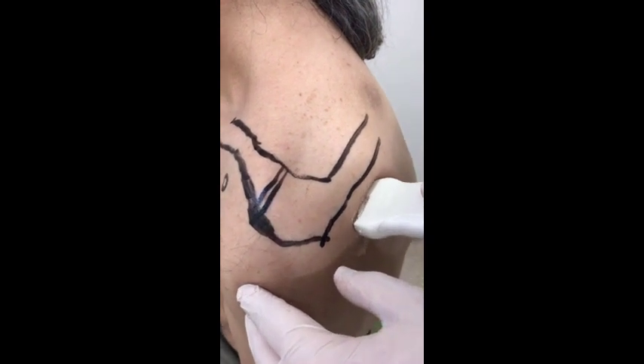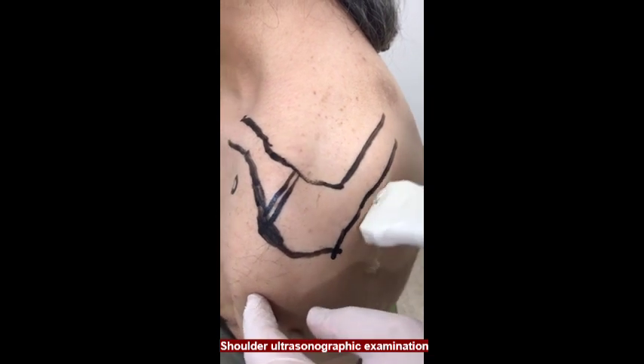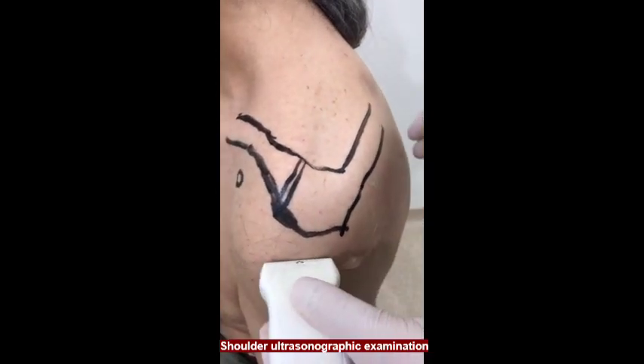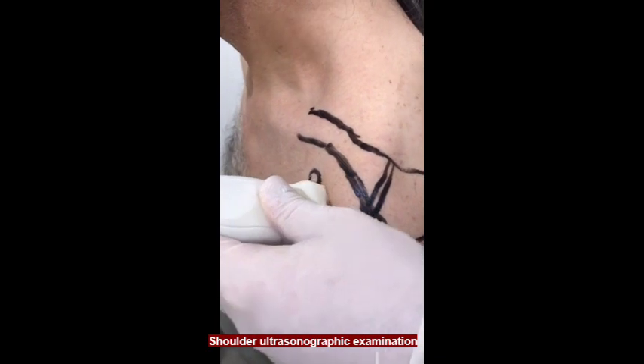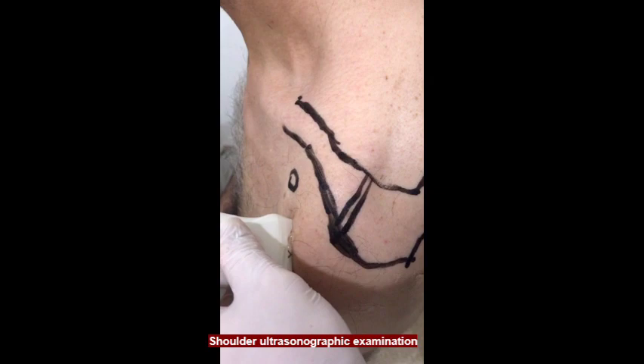Shoulder ultrasonographic examination is routinely performed for possible pathologies. First, the glenohumeral joint, supraspinatus, and infraspinatus are checked. Then, the subacromial space, the biceps long head tendon, the coracohumeral ligament, and the subscapularis tendon are examined.